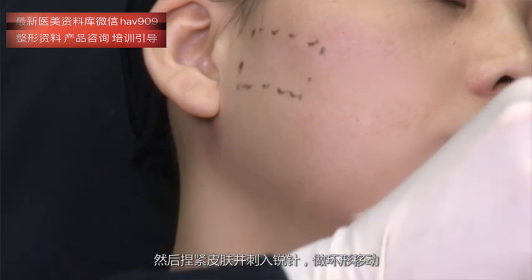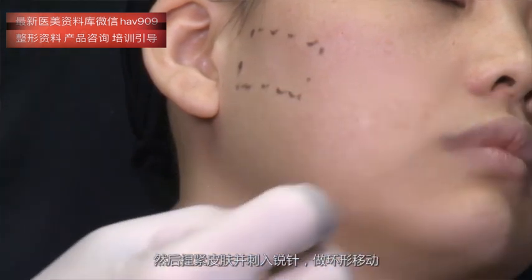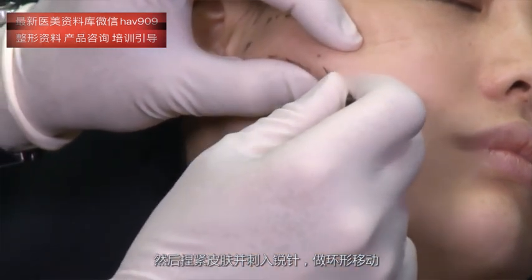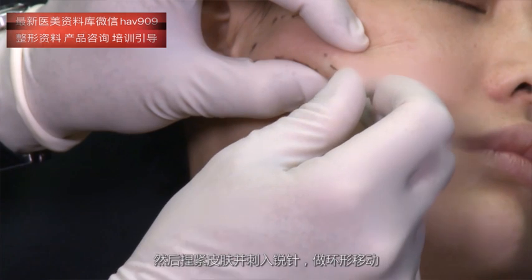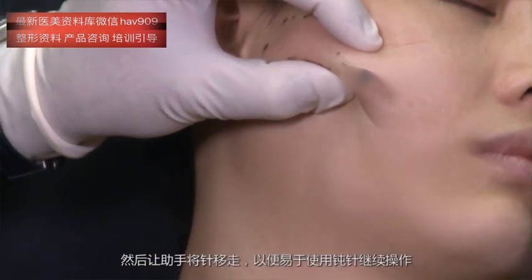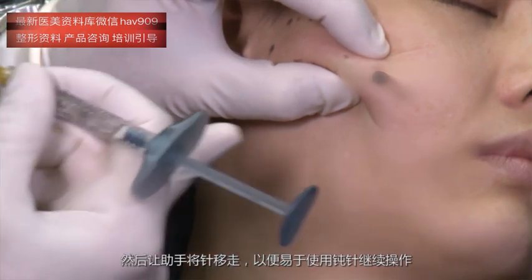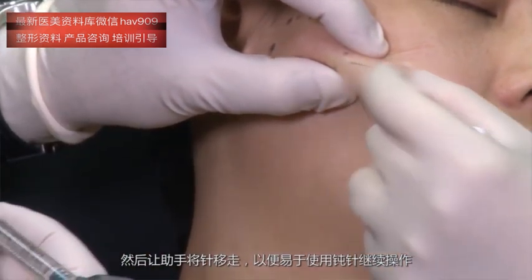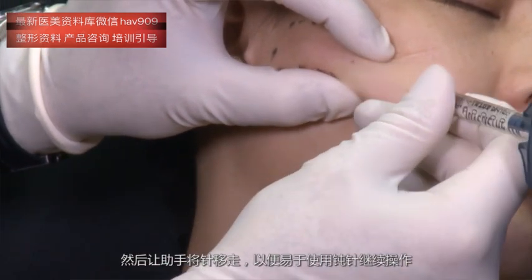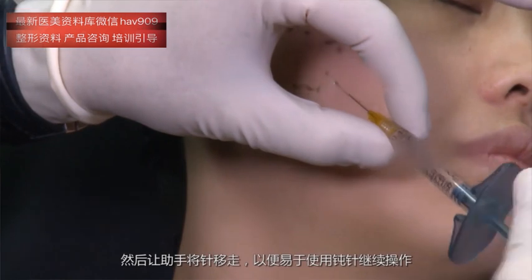Then I pinch to penetrate the entry point with the needle. I make a round movement. Then I ask my assistant to remove the needle so that I can easily progress with the cannula.